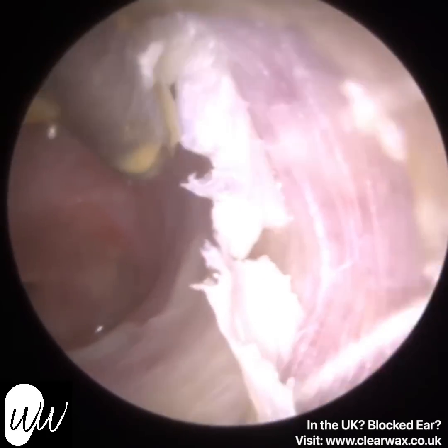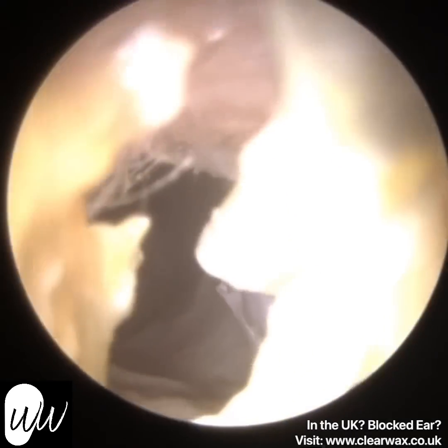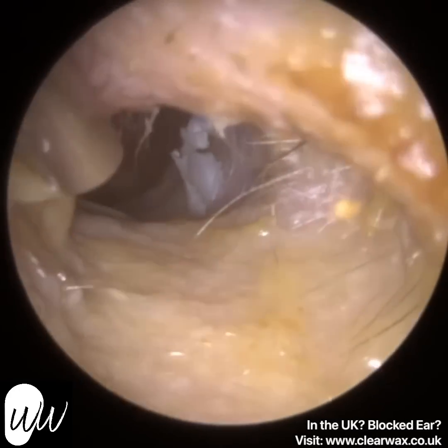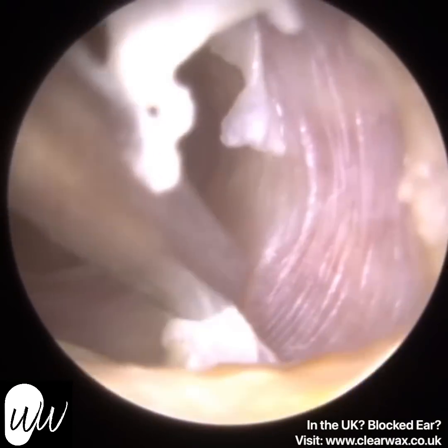You could also categorise the infection as something called a suppurative otitis media, so that's when you've got a middle ear infection, which this patient does have, because it's very likely all this discharge that I've cleaned out is actually originating from the middle ear as opposed to the ear canal itself.